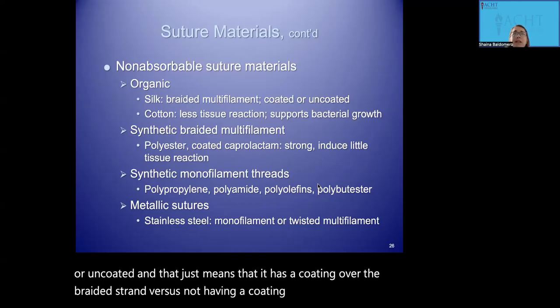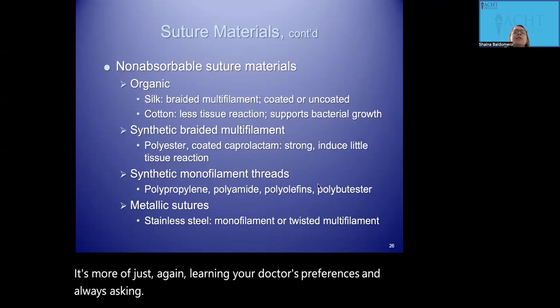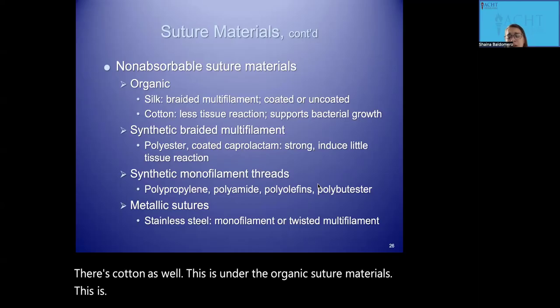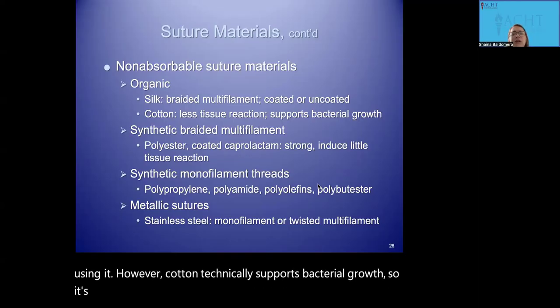Again, you don't really need to know those differences. It's more of just, again, learning your doctor's preferences and always asking. There's cotton as well. This is under the organic suture materials. It does cause less tissue reaction while using it. However, cotton technically supports bacterial growth, so it's not used very much. You'll see silk used often.